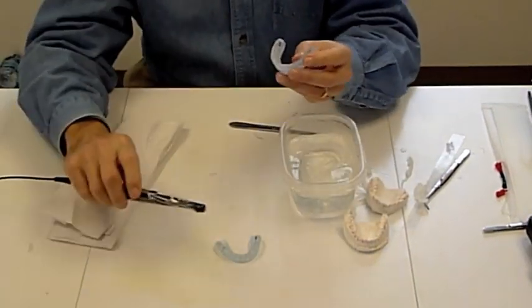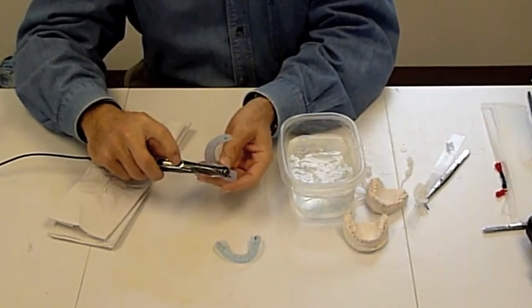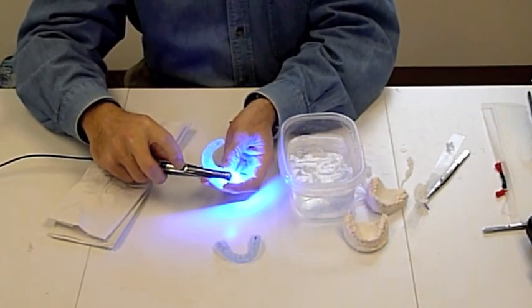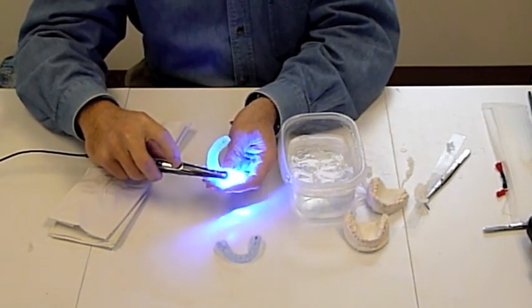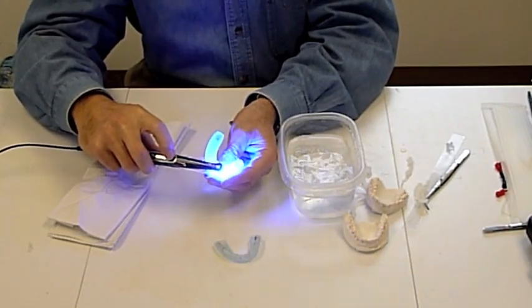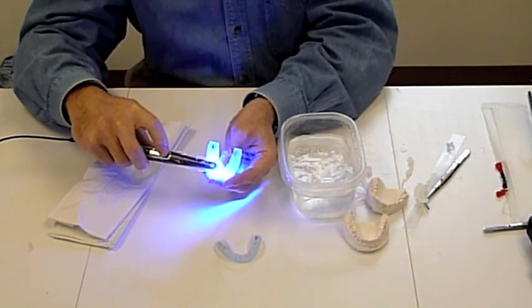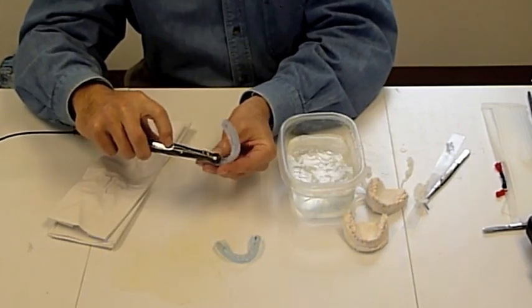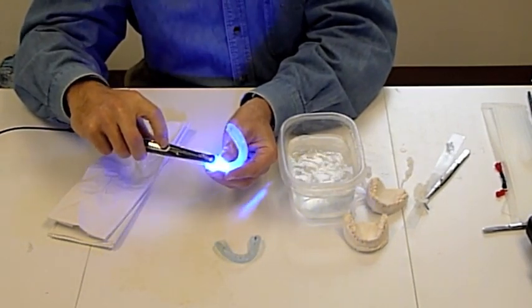It's important to go ahead and re-cure any metal brackets with the Velo light just to make sure that the plastic is cured. The ceramic brackets, because of their nature, the fact that they're clear, are going to cure all the way through when exposed to the Velo light.